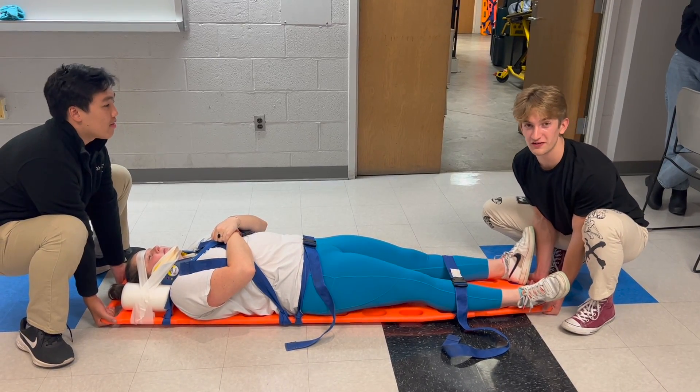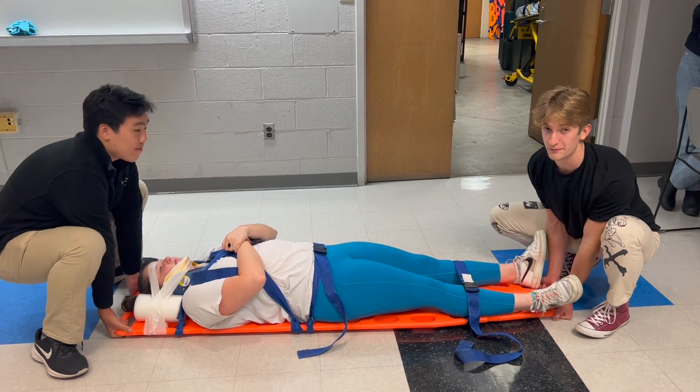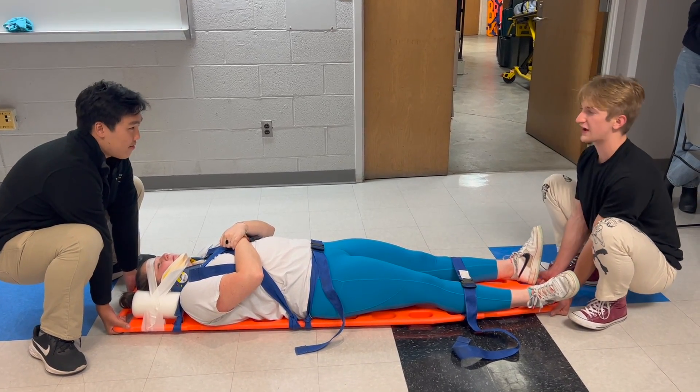We will now demonstrate a two-person lift on a spinally immobilized patient. Remember to lift with your legs and glutes, and never with your back.